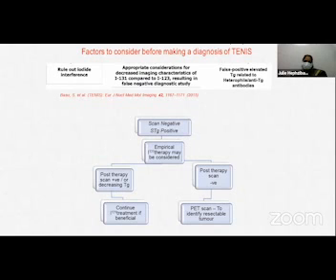So in our center, when a scan is negative and the TG is positive, we do what is called empirical therapy, although it's quite a debatable option, and do the post-therapy scan. If the post-therapy scan is positive or there is a decreasing thyroglobulin trend in the follow-up, continue the treatment if it is beneficial. If the post-therapy scan is negative, do a PET scan to identify resectable tumor.